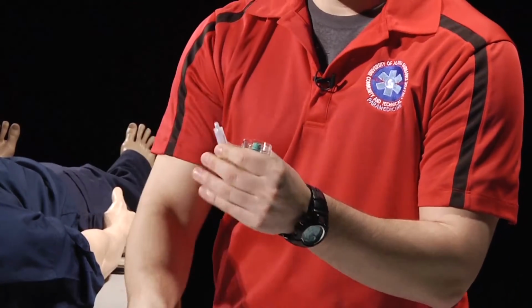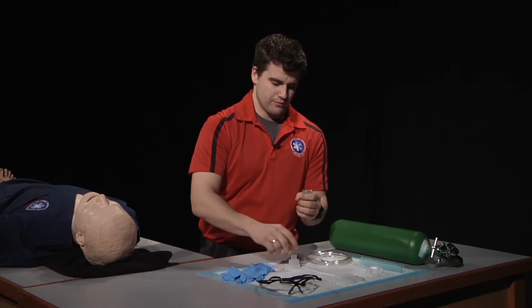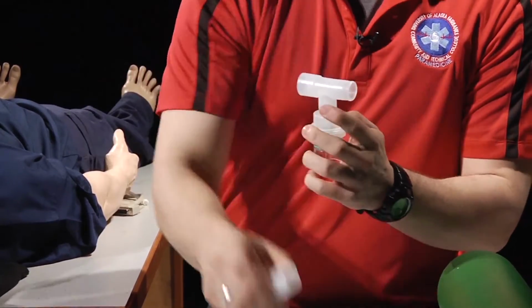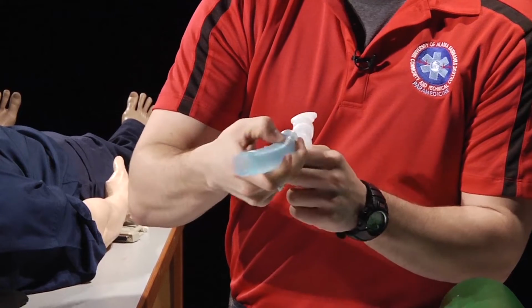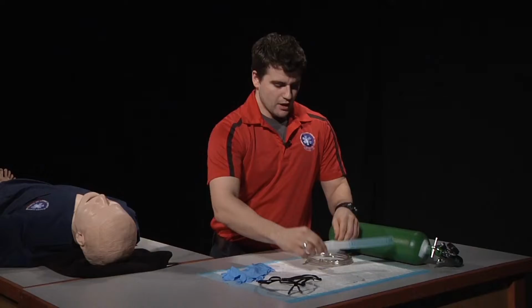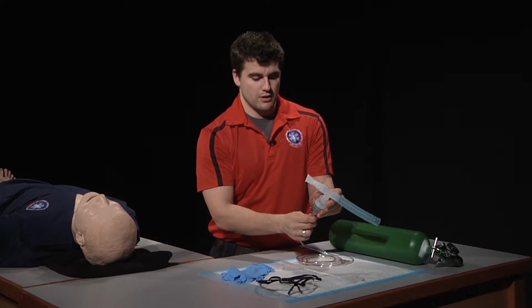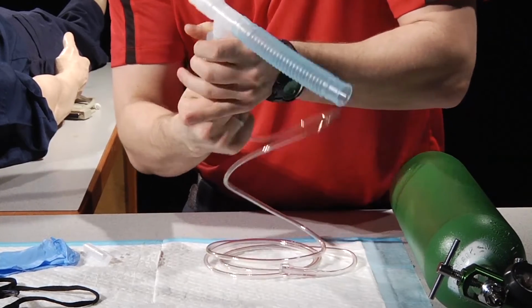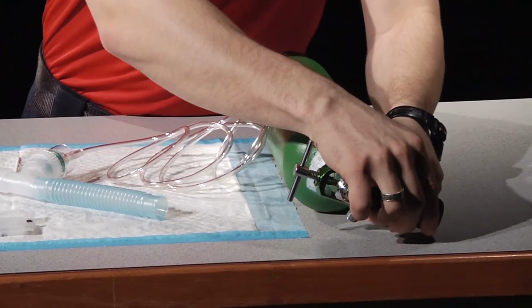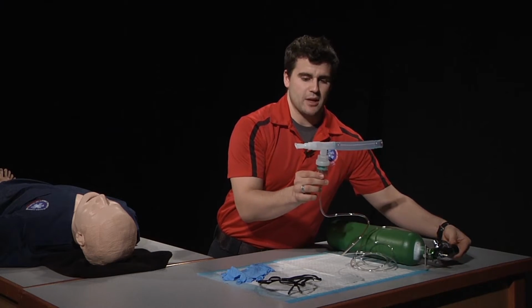We'll remove the cap and squeeze in. From there, we'll attach the T-piece, our mouthpiece, and our extension tubing. Next is to attach the O2 tubing. This is going to go from the nebulizing unit to the oxygen tank. We're going to now turn on the oxygen tank until we see misting coming from either end.